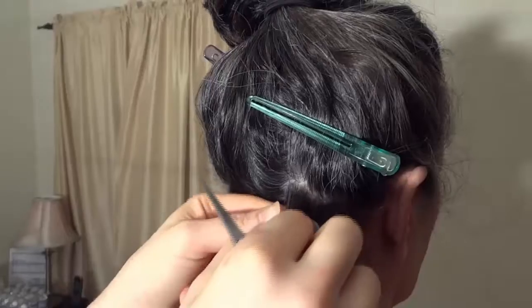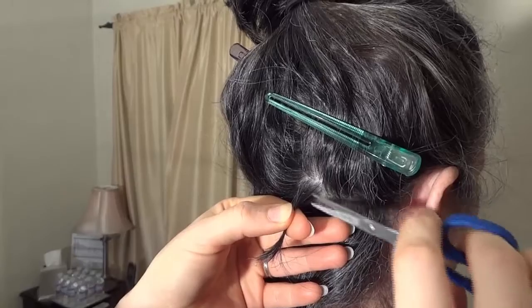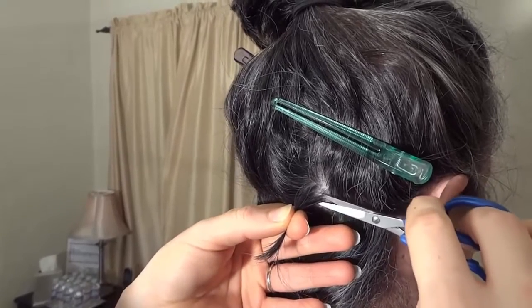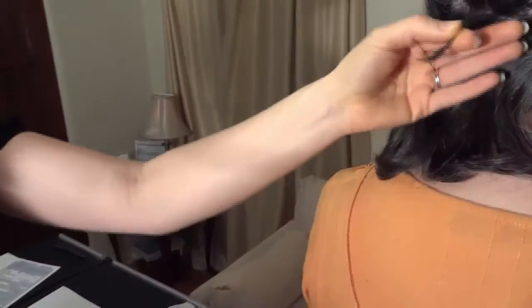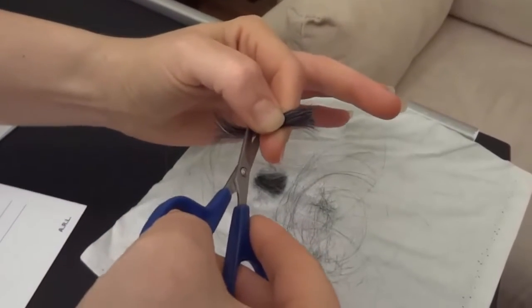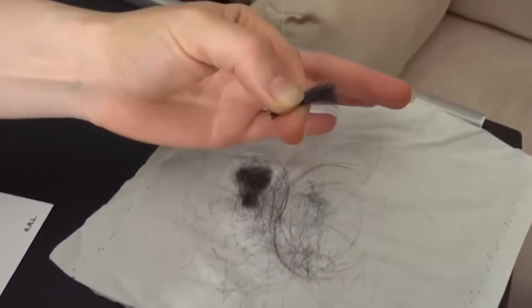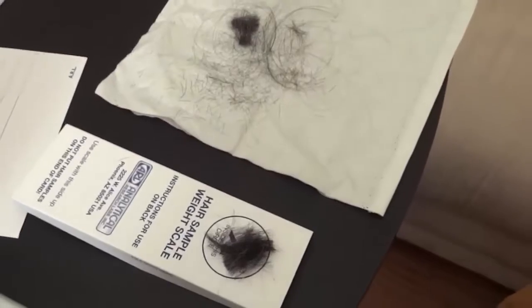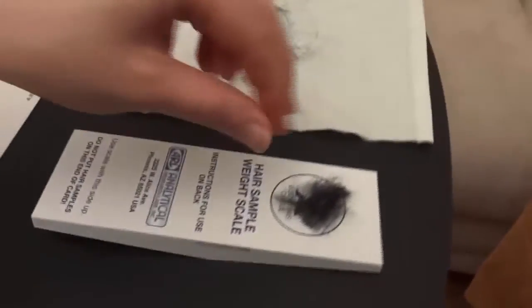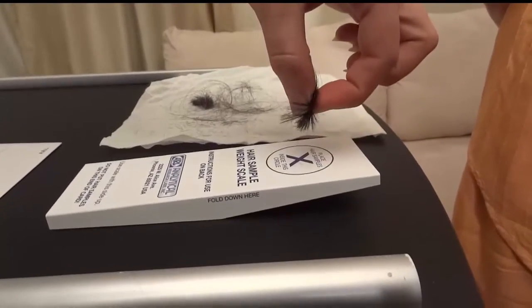Since the scale hasn't tipped yet, we are now going to go to the other side where the second sampling location was, and we will cut some of that growth. We only need enough hair to tip the scale. And we'll cut the long ends off of this as well. And then place the hair on the X part of the scale. As you can see here, the scale has now tipped. This is enough hair to be sent to the lab, so we do not have to cut any more.